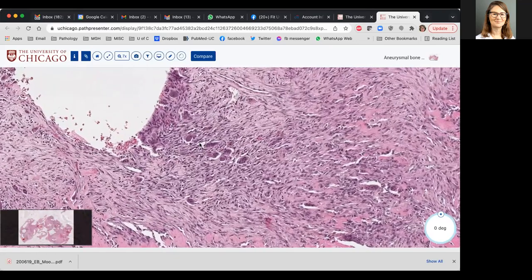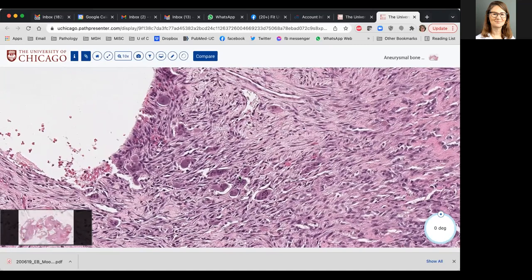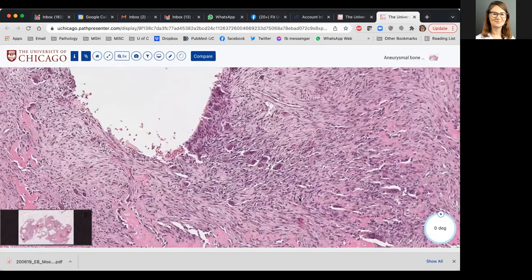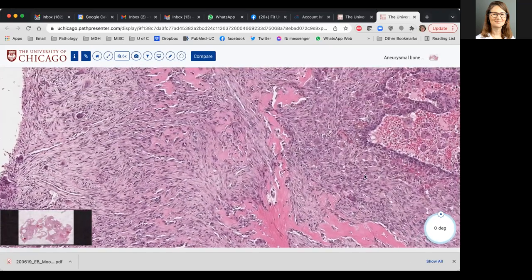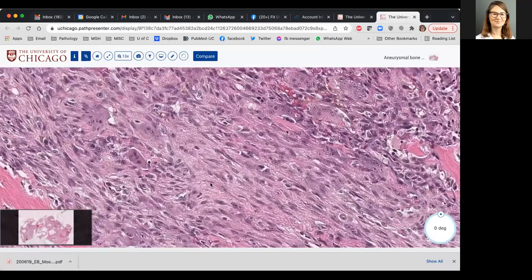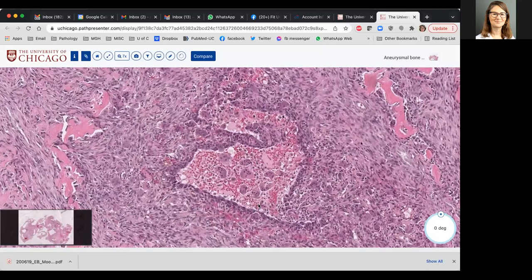So if you're now thinking about a category of giant cell rich lesions of bone, which chondroblastoma is, as well as aneurysmal bone cyst, you can see here the giant cells. Generally, the distinguishing feature for me about an ABC is the stroma in the background being extraordinarily more spindled than what you would see in either a chondroblastoma or a giant cell tumor of bone. In areas you have giant cells, but in other areas you have that characteristic more spindled stroma. You certainly can have the giant cells jumping off the cliff right into the cystic spaces.